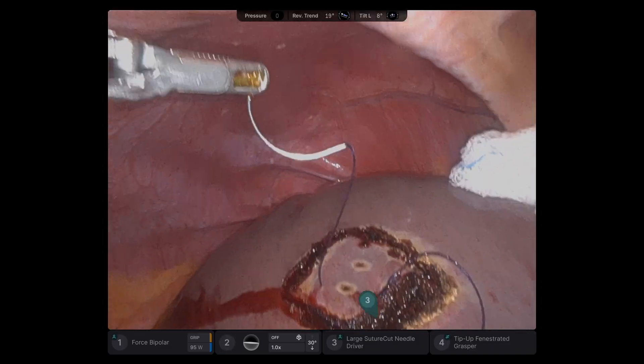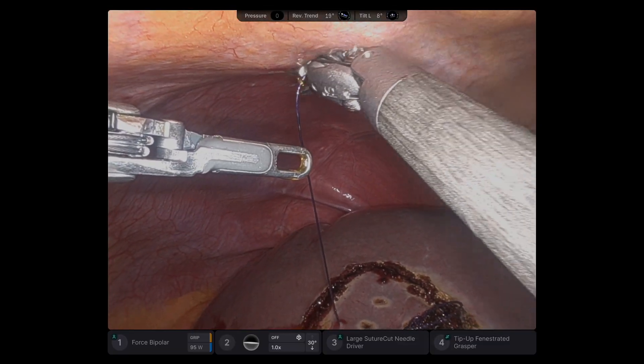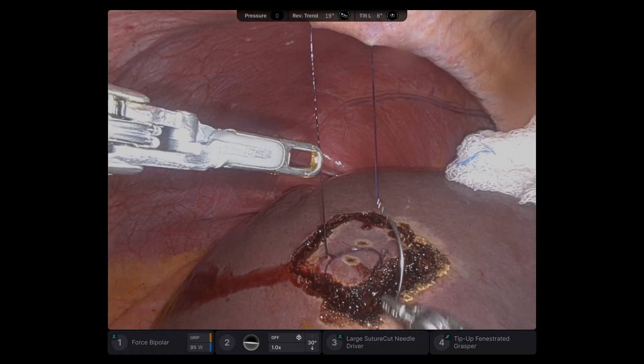My third arm is pulling on the liver with the Raytec to give me this exposure. So basically, 3-0 V-Log — take two big bites in the specimen, and then just lift up.